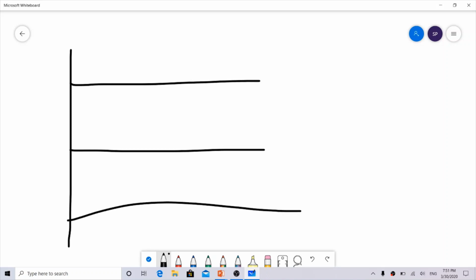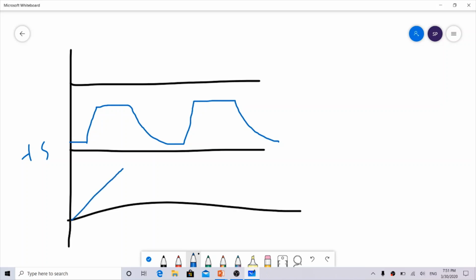Let's say the patient actually stopped breathing. When the patient has stopped initiating breaths, we'll get a backup rate. What we said was 14. So here we have a PEEP of plus 5. Instead of getting down, we'll see a rise in pressure, and we'll see a fall, again down. So here you can see, and this will remain the same.